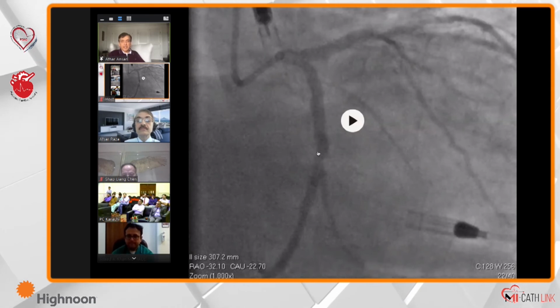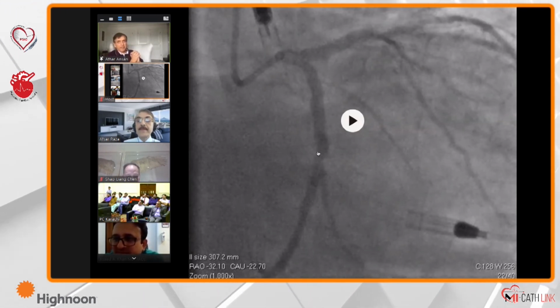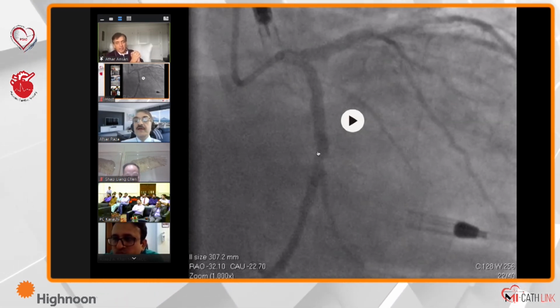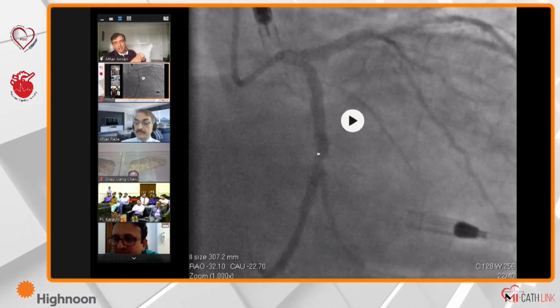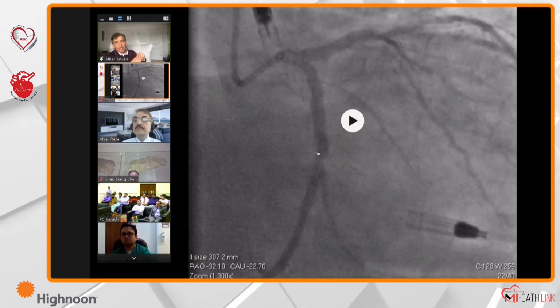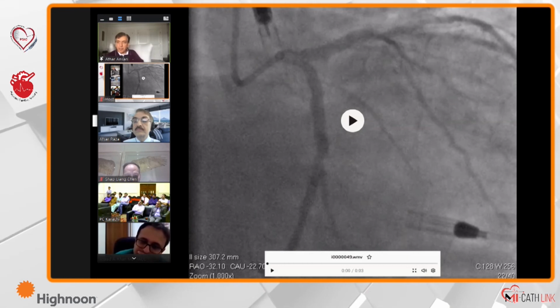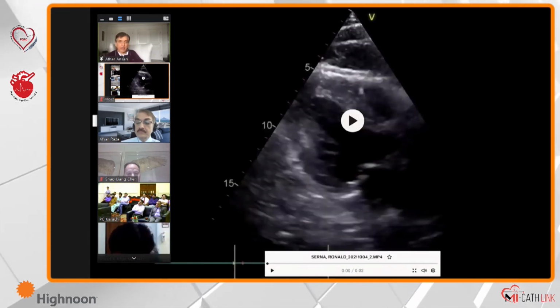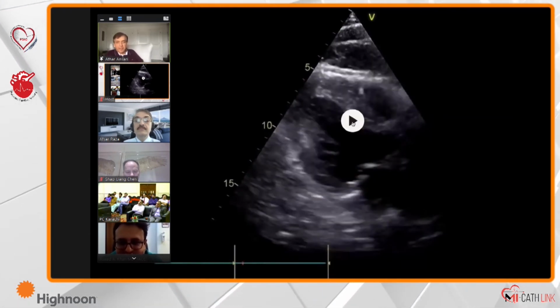So the patient, immediately with a Smart Assist Impella, was doing about 3.5 of cardiac output. I was able to wean it off. I think we were done in about 25, 30 minutes, this whole case finished. He was transferred and then discharged, and we were able to take the Impella out in about 3 days. His ejection fraction improved completely, and I will show you his follow-up. Here we go, this is a follow-up on discharge. His EF is about 45 to 50%.